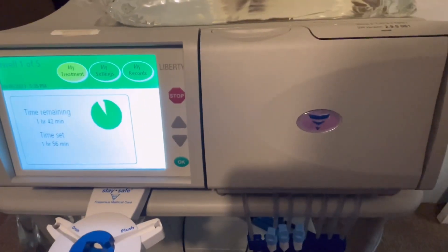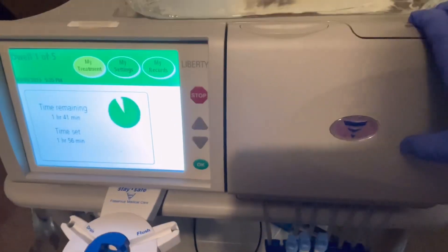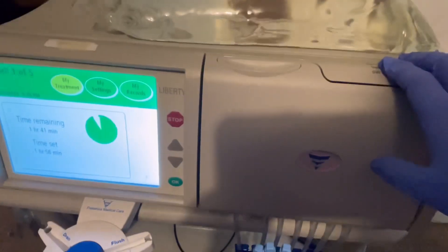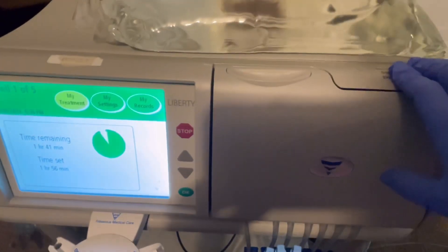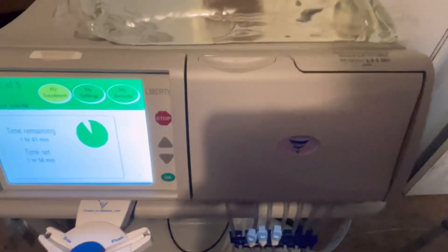This is the peritoneal dialysis machine and it's from a manufacturer called Fresenius. If you have any questions you can drop me a message below this vlog, and watch for more videos regarding dialysis. Thank you.